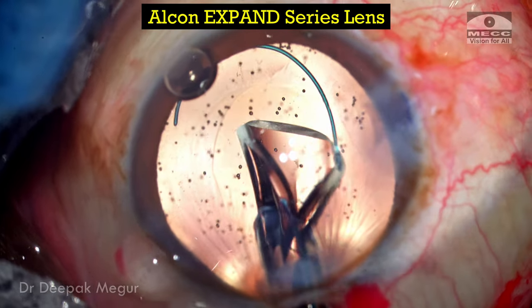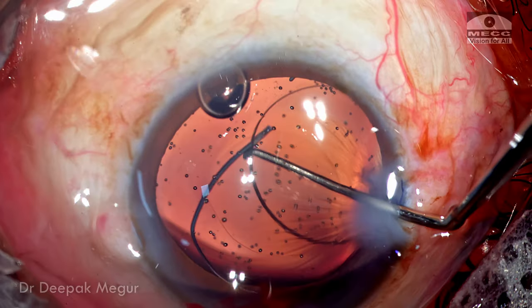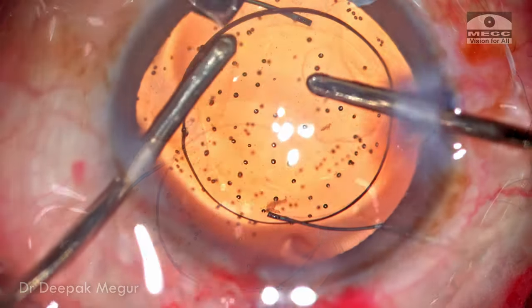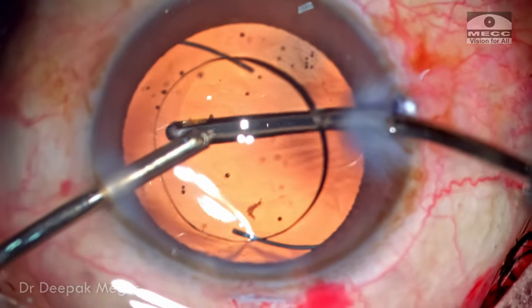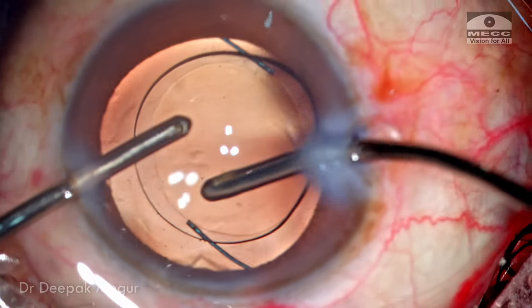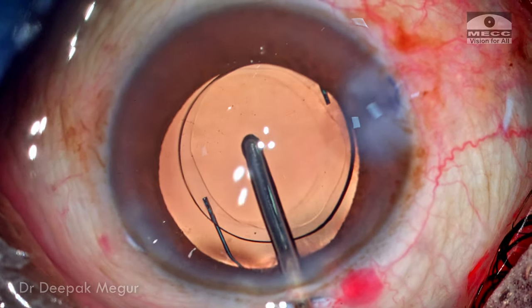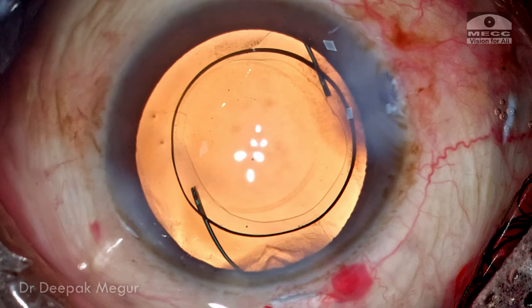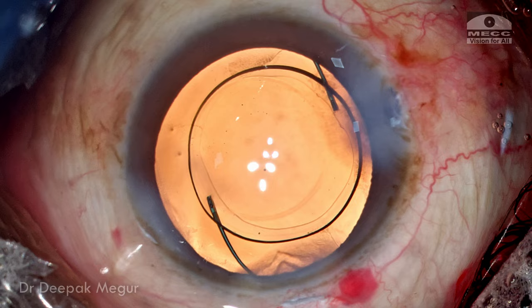This is the multi-piece lens of the Expand series which I'm going to implant. It looks like a typical multi-piece lens — nothing special. The lens is dialed into the capsular bag. OVD both in front and behind the lens is aspirated out. Checking the centration of the lens and the rhexis size — the rhexis size seems okay but there's a mild eccentricity, though it should work well. The side port and main incisions are hydrated. The case is done.